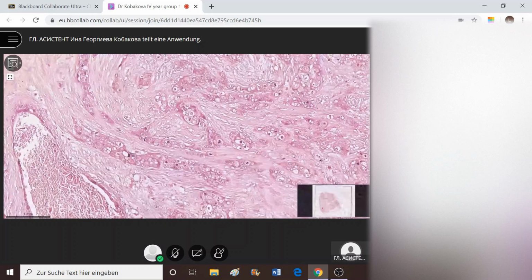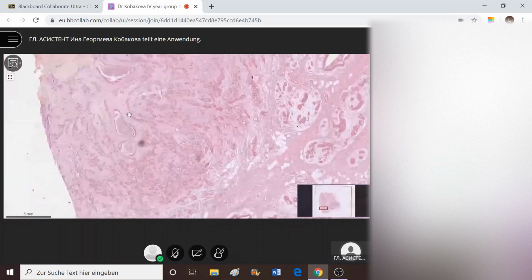So that you will differentiate whether it's ductal type of carcinoma or lobular type of carcinoma, or whether it's infiltrating in sheets like Indian file pattern, because cells a little bit look separated at the periphery of the slide, or whether they keep the adhesions with each other, and it's more like ductal infiltrating.